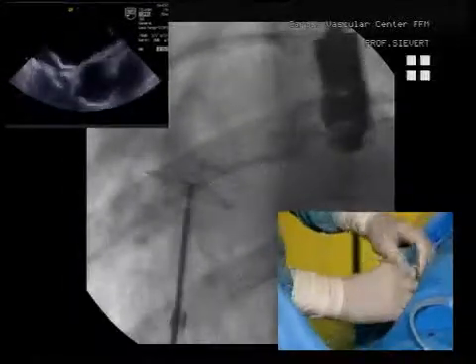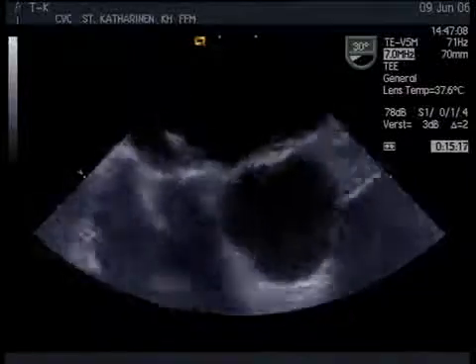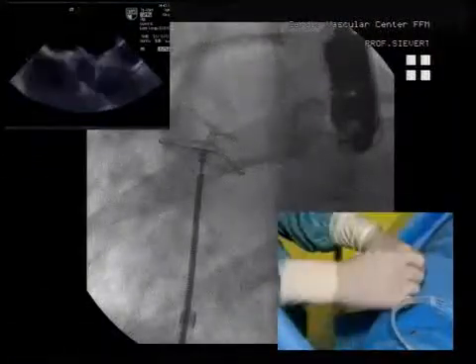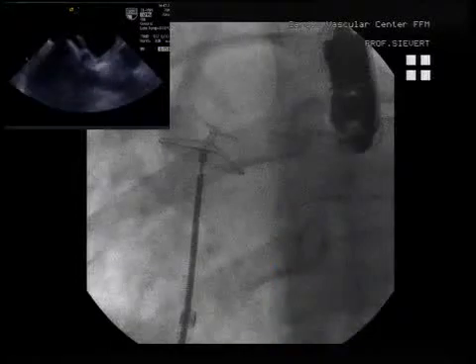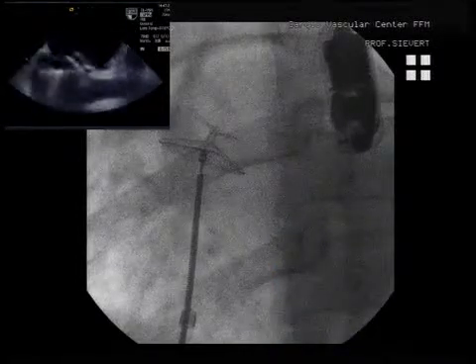What about the echo? It seems nice. Will this technology also work for ASD devices? The other things are in development, but in the clinical trial we just have the PFO device. As you see, it's much less material in the left atrium. It never protrudes into the left atrium like a double shell.